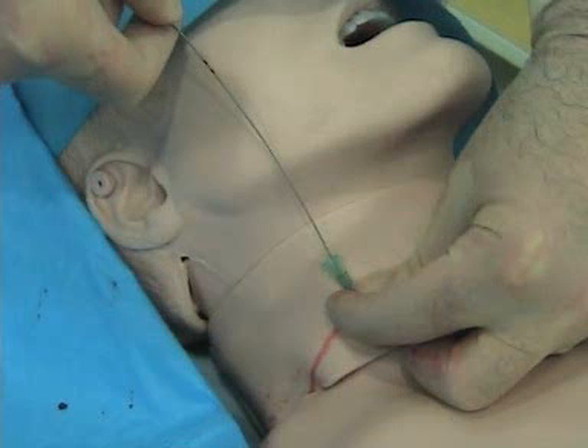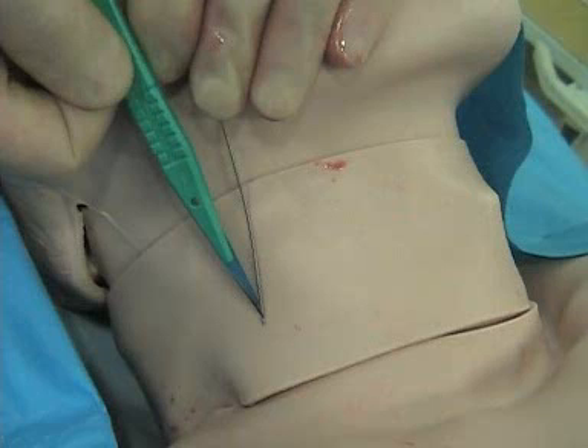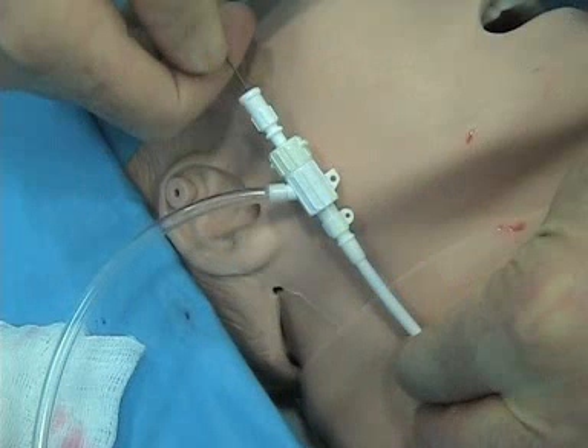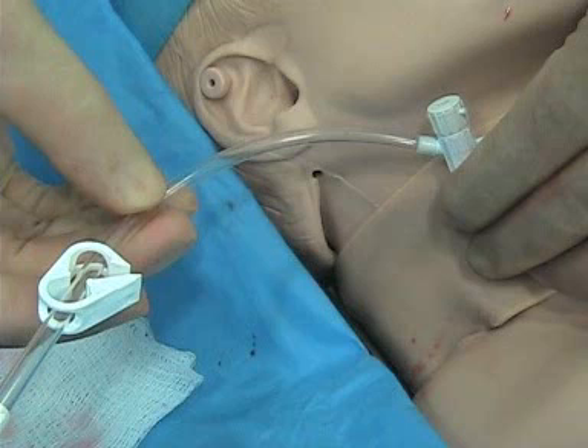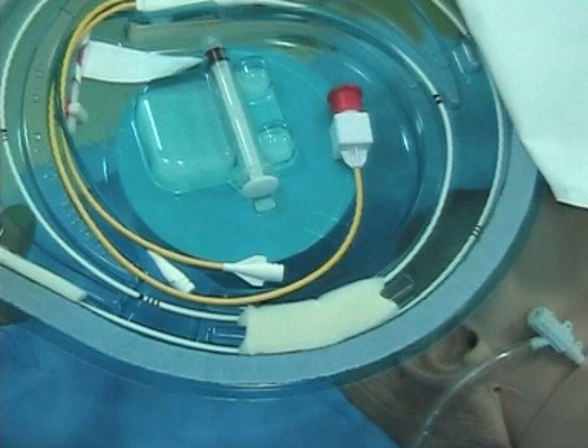Now that you've confirmed placement, put the wire back in and it's back to business as usual with the Seldinger technique. You make a nick in the skin. Here I'm putting in a cordis introducer and slide that all the way in, pull things out, and then — as with every other line — aspirate out all the blood from it and flush it out. After that, we'll be ready for the Swan.